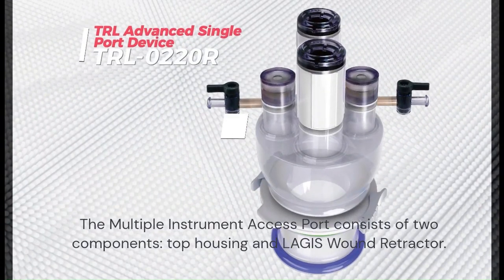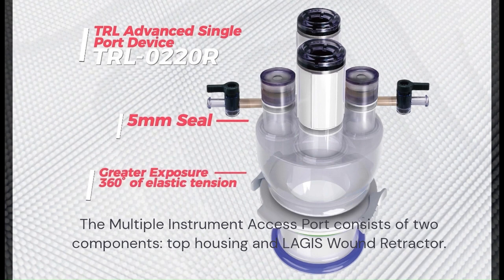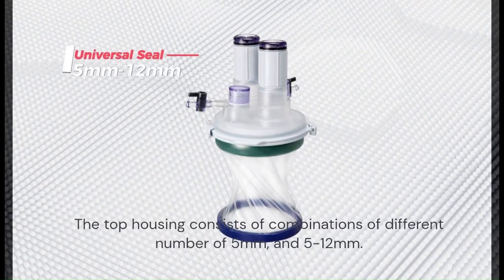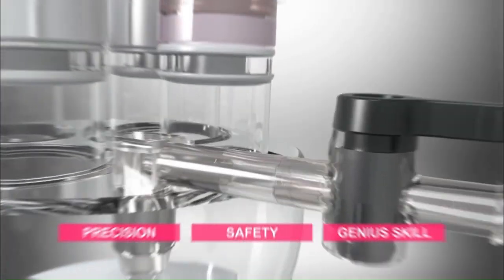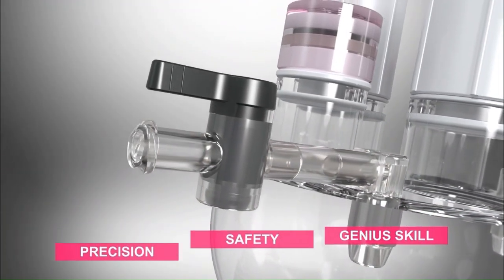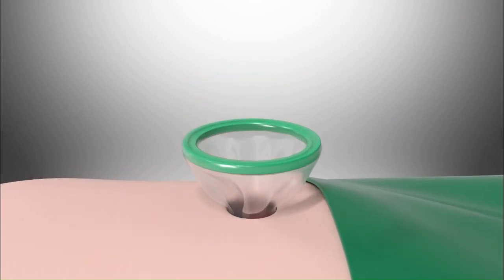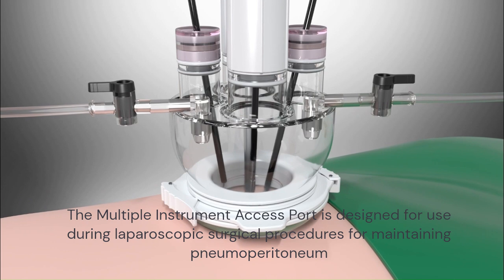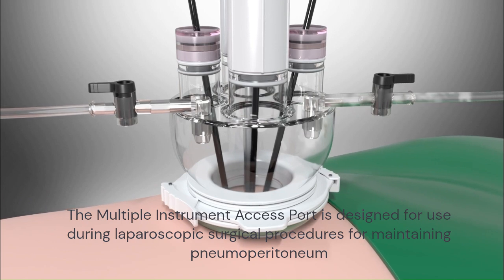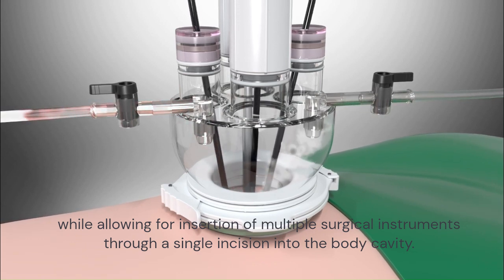The Multiple Instrument Access Port consists of two components: top housing and LAGIS Wound Retractor. The top housing consists of combinations of different numbers of 5mm and 5-12mm ports. The Multiple Instrument Access Port is designed for use during laparoscopic surgical procedures for maintaining pneumoperitoneum, while allowing for insertion of multiple surgical instruments through a single incision into the body cavity.